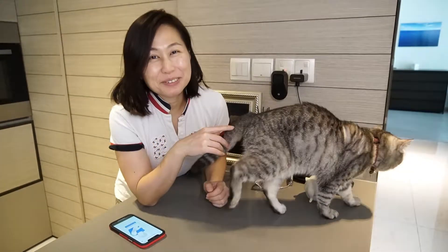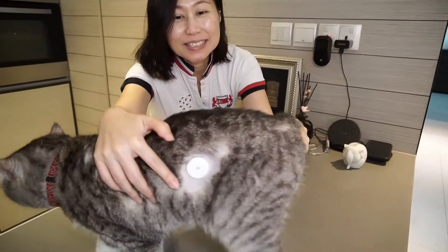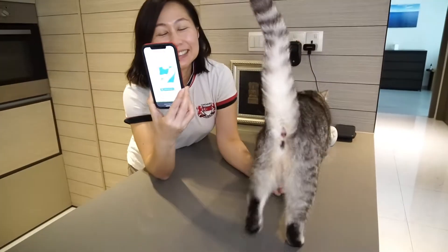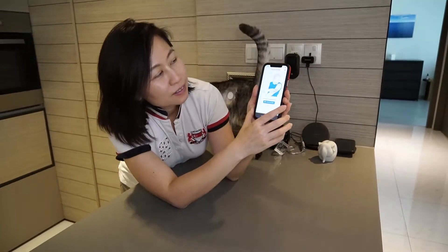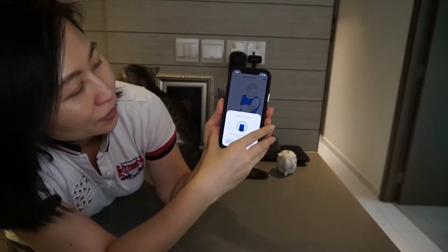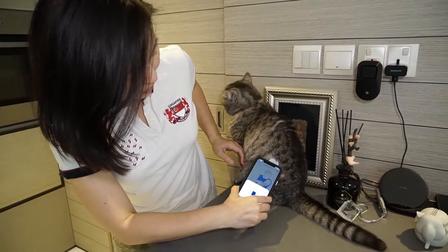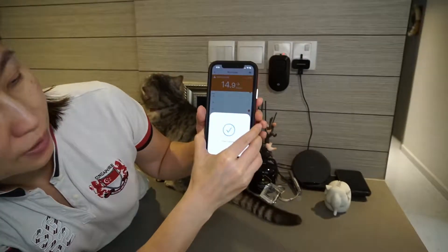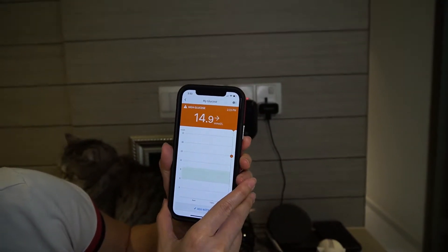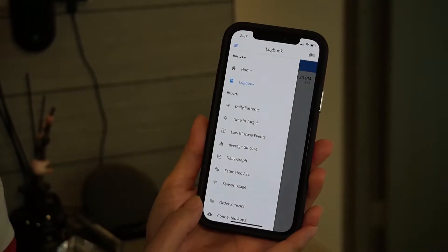We're back from the vet, and the vet has put the sensor on her body, as you can see over here. This is the app, and this is where you can click to use the sensor. All I need to do is place my phone close to it — and there you go, the scan is complete. It shows her blood glucose level as high for now.